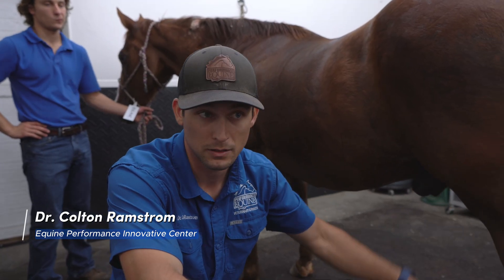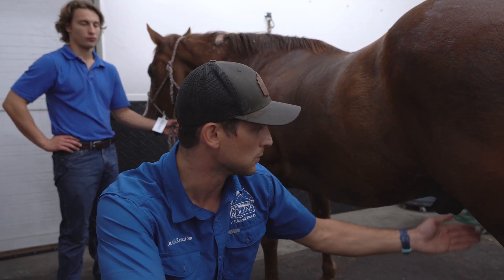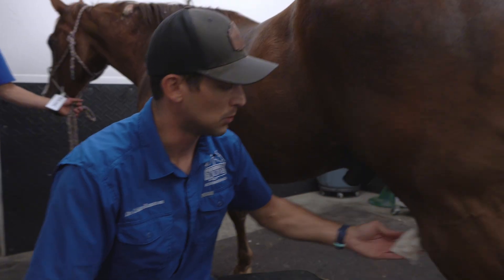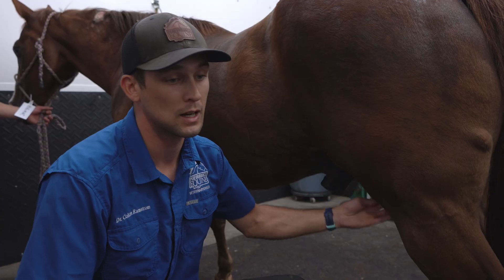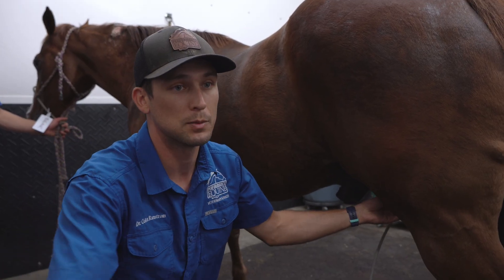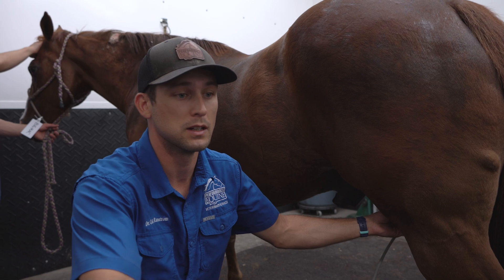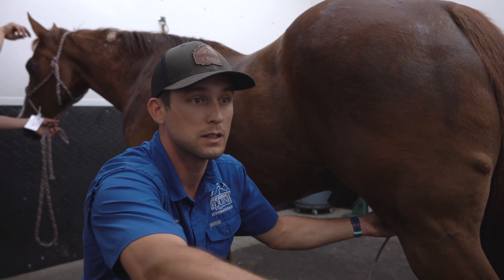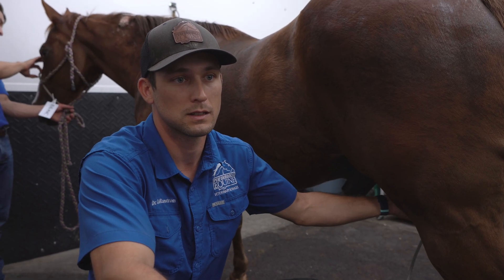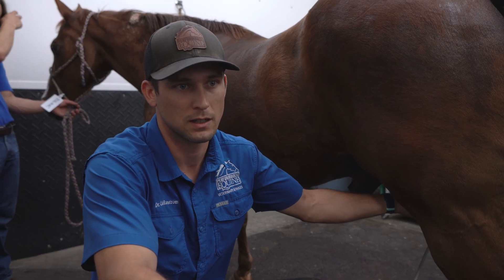Before doing any blocks or anything along those lines, we're going to do some imaging — check all our main spots: hock, stifle, suspensory — and see what all that looks like. Both straight line and left and right circle on the lunge line showed strong left hind lameness. He's got a little bit of drop in this left hind fetlock too, which in a 20-year-old horse makes me think there might be a little bit of degenerative suspensory ligament disease, or degenerative suspensory ligament desmitis. So we're going to take a close look at that suspensory ligament in addition to checking some other spots higher up.